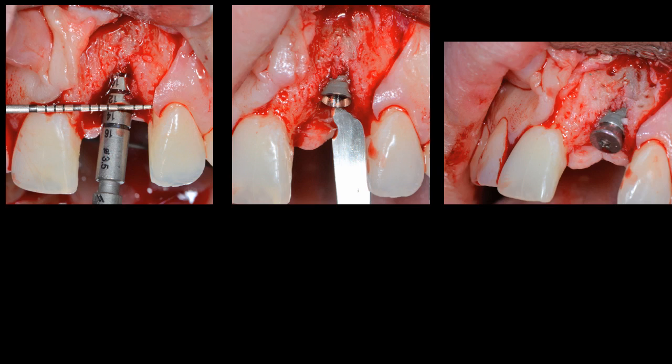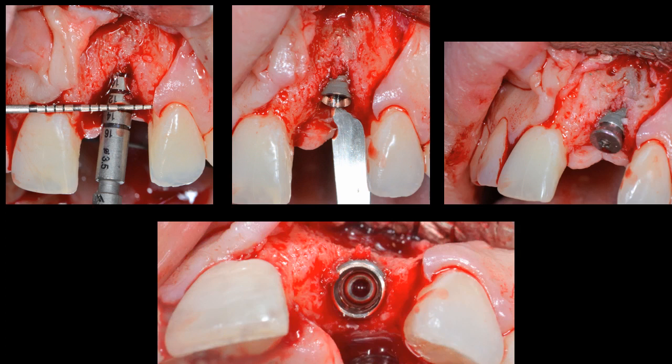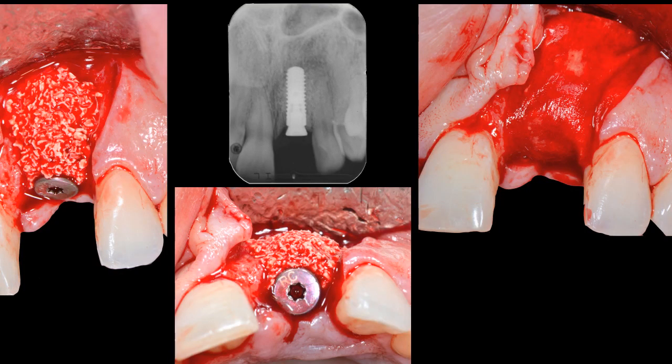The implant was placed with a very good torque, about 35 Newton centimeters, and it's a Straumann bone level 4.1 by 12 implant. So after decortication of the buccal, what remaining of the buccal plate, we then decided to graft the deformity with a xenograft. This is it, as you can clearly see, about 2 to 3 millimeters of thickening to recreate that lost space.